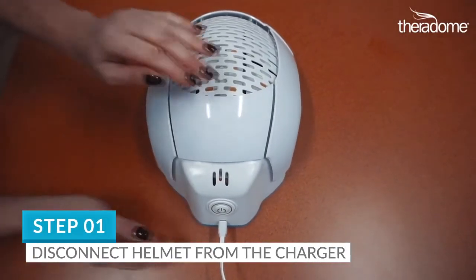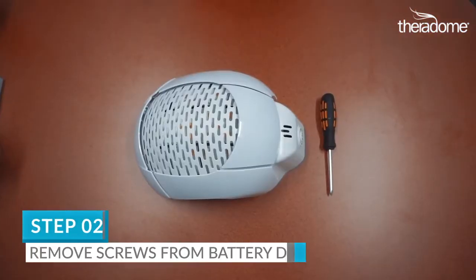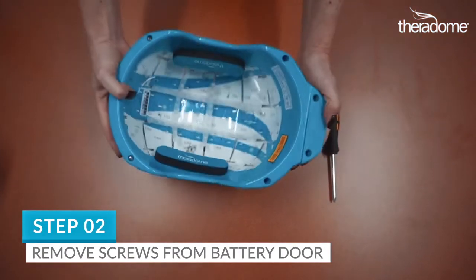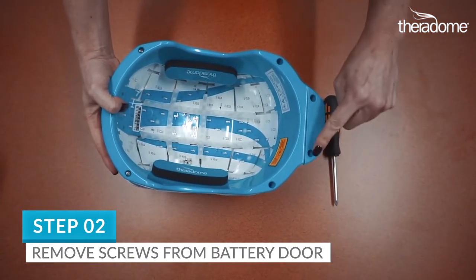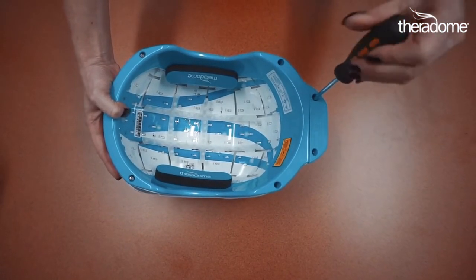Step 1. Please be sure your helmet is disconnected from the charger. Step 2. On the rear of the helmet you'll find two screws that fasten the battery door. Remove them with a Phillips screwdriver and set them in a safe place. You'll need them later.